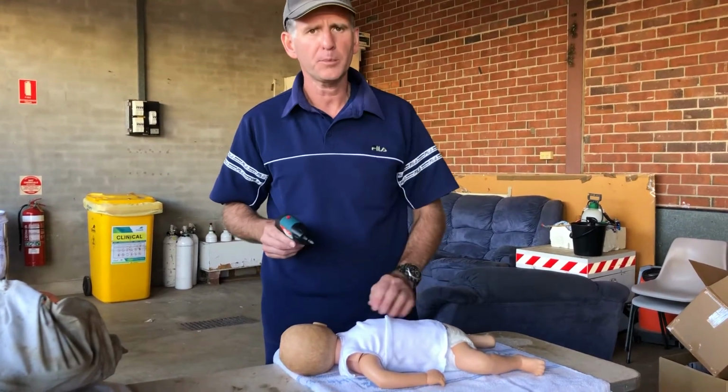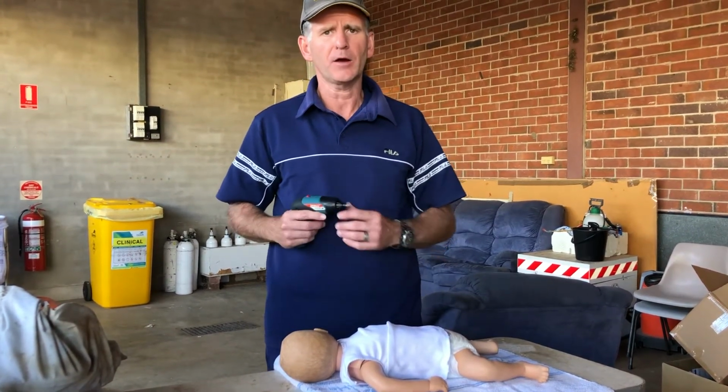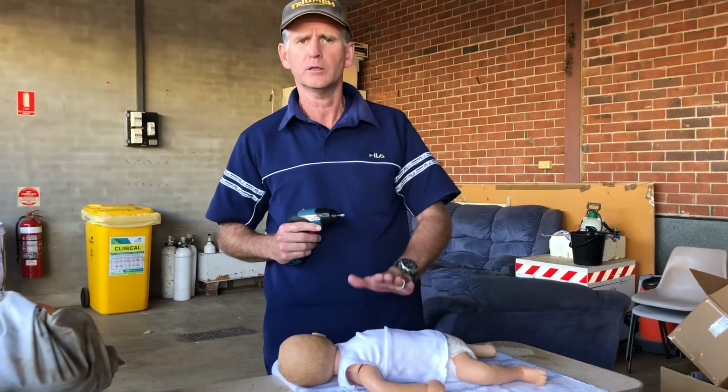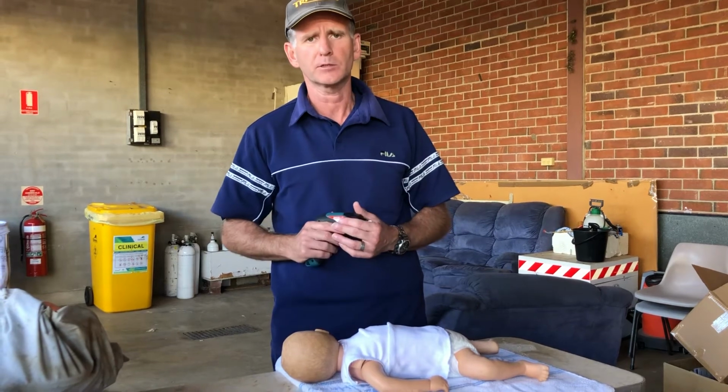The child's quite floppy, really doesn't care. I think this little fellow, or lady, is in a world of hurt and a world of her own, and I don't think this is going to worry them too much.